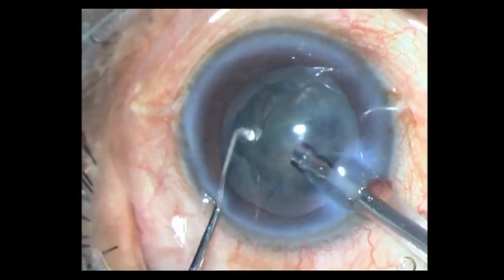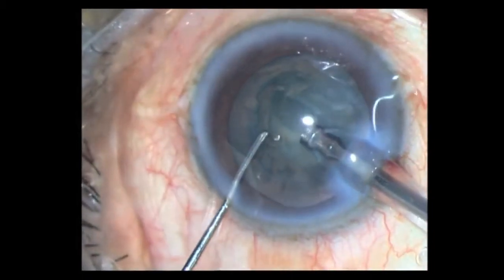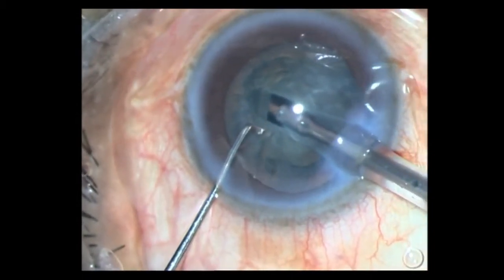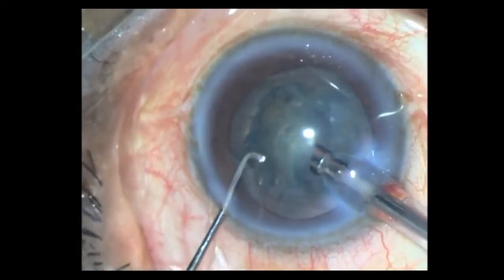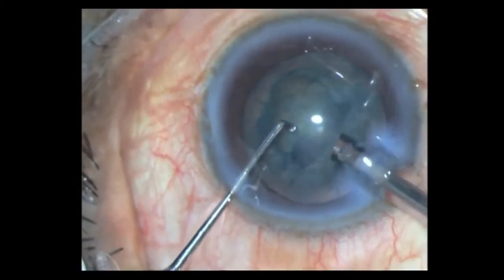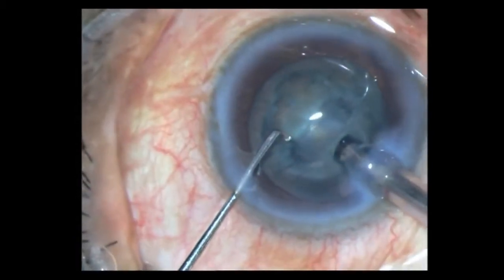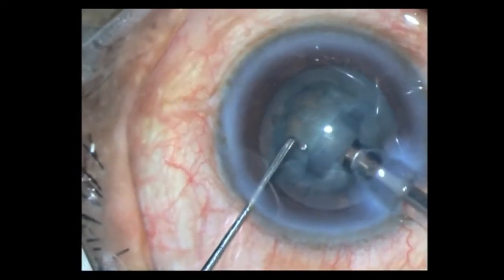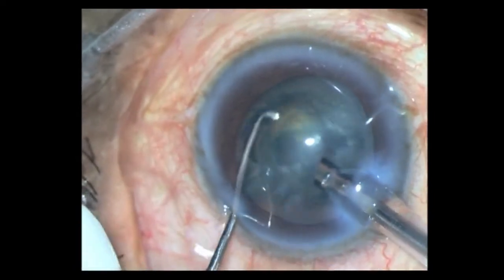Making sure the trench is deep on the other side as well. Now making the cross-shaped sculpting — I make one side and can still deepen it down there, then rotate it to do the other side as well.